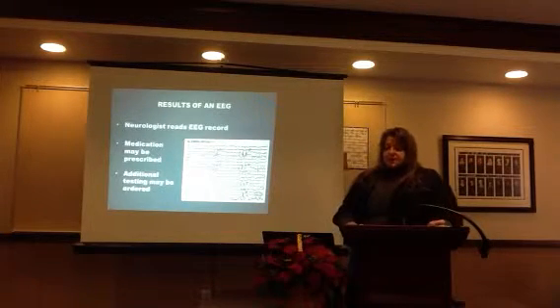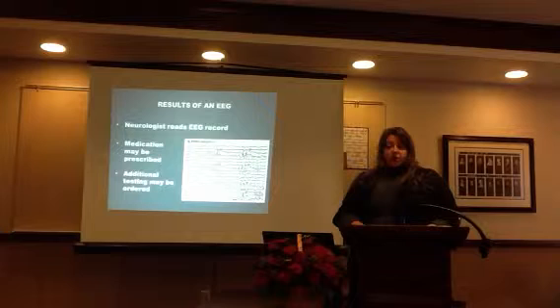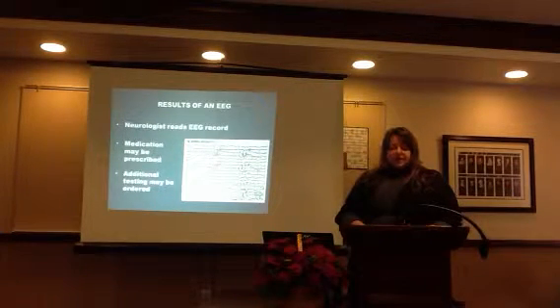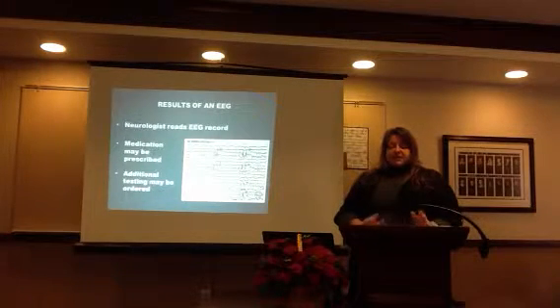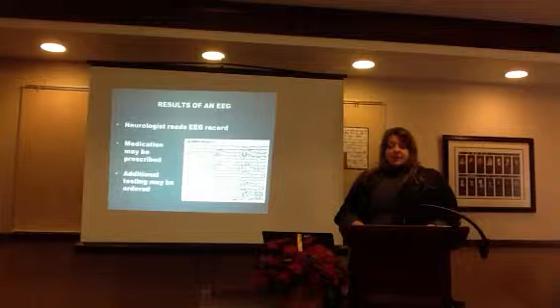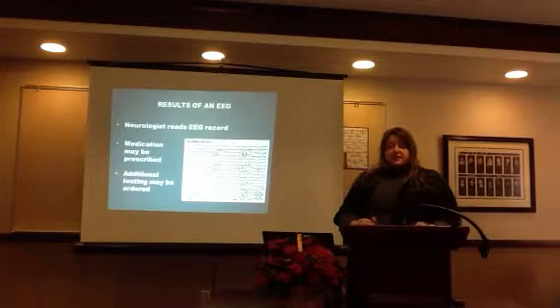In some cases, neurologists may order additional testing, even though the EEG has been done. This is because different tests tell different things about the brain. The EEG is the best way to monitor the brain waves, but it does not give an accurate picture of the inside of the brain.